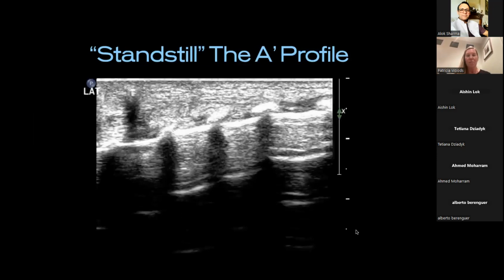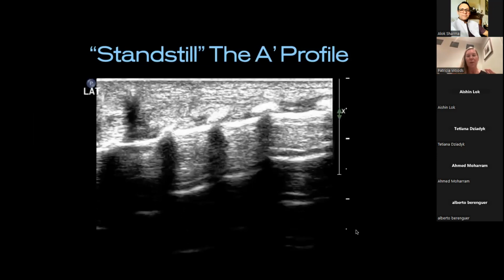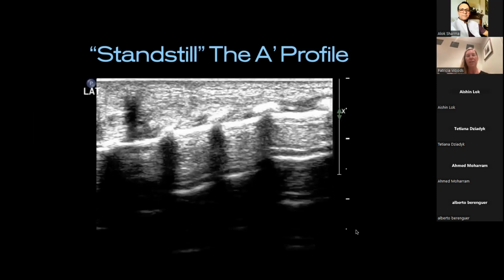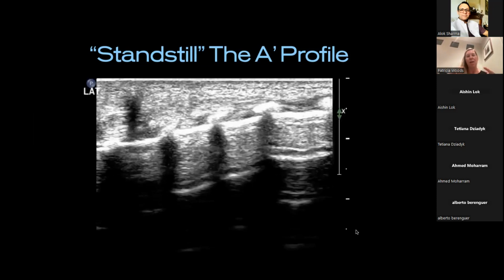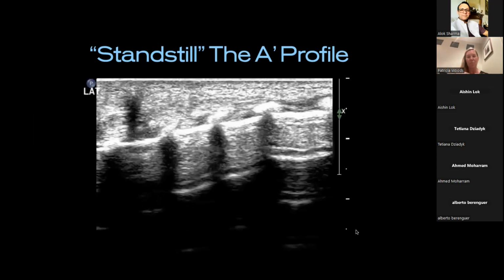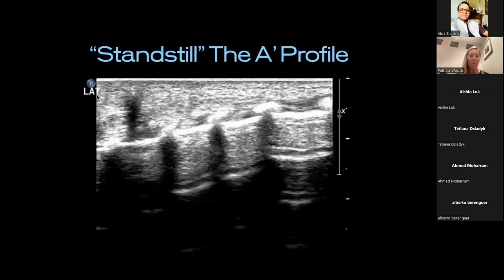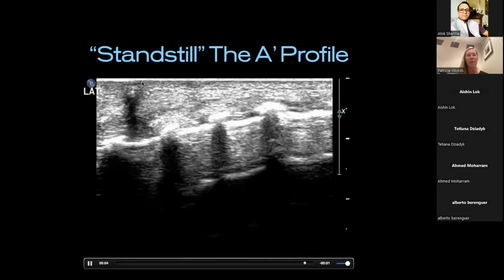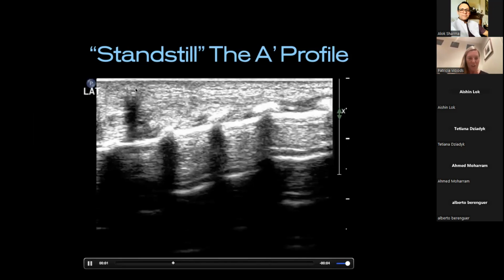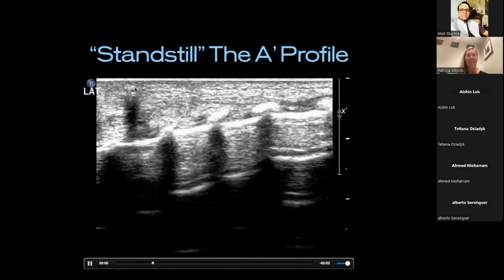I like to think pneumothoraces is about standstill. So observing here, you can see how there is just static nature of this pleural line. It's thin, it's well defined. You can see the chest wall here. And this is actually a baby with a little pigtail catheter. I want you to note this little part carefully here. You get a little bubble arising occasionally.